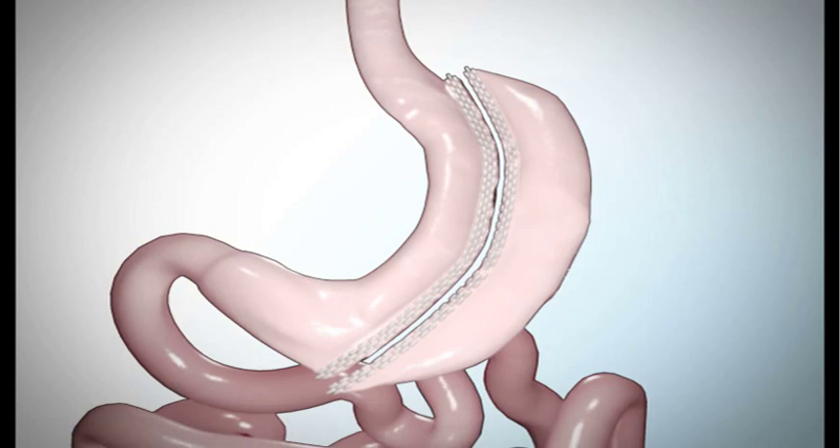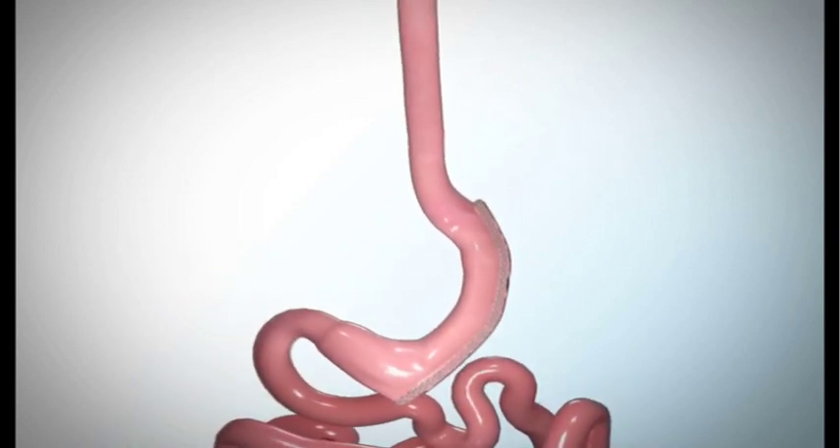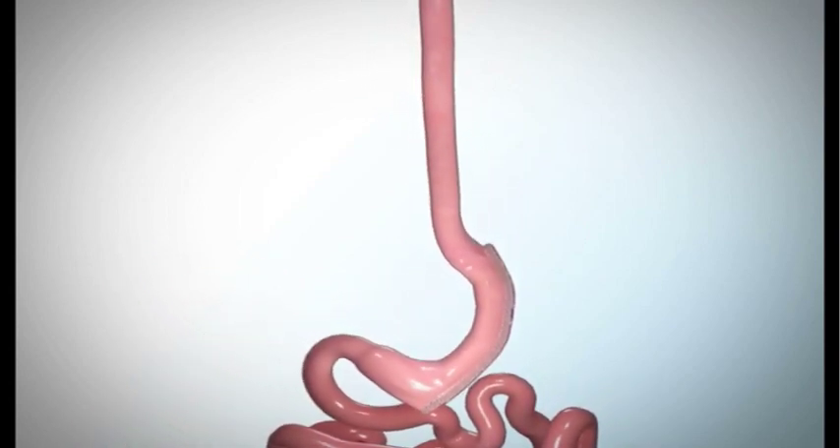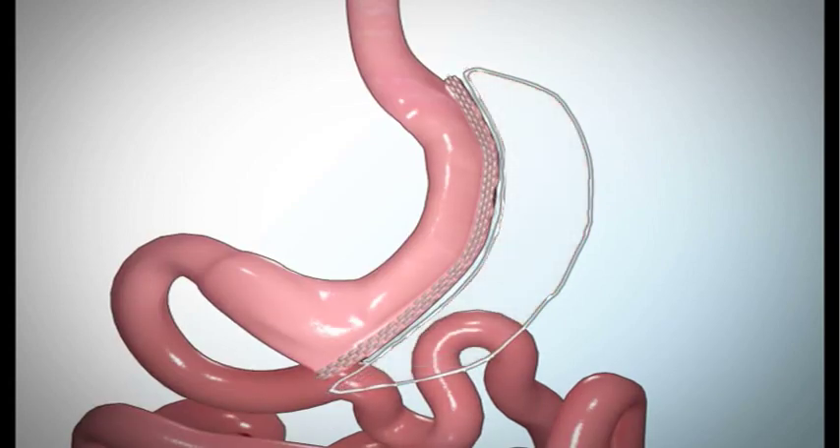The third step in the sleeve gastrectomy is removing part of the stomach. Your surgeon will remove the left part of the stomach, which includes the fundus. The fundus is one of the areas of the stomach that produces the hormone that controls your appetite. The remaining portion of your stomach will be about the size and shape of a banana.